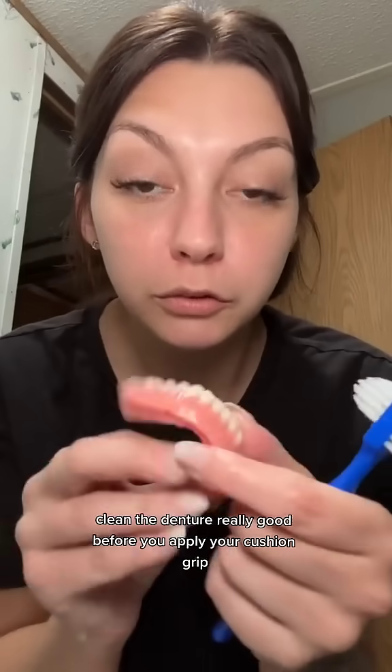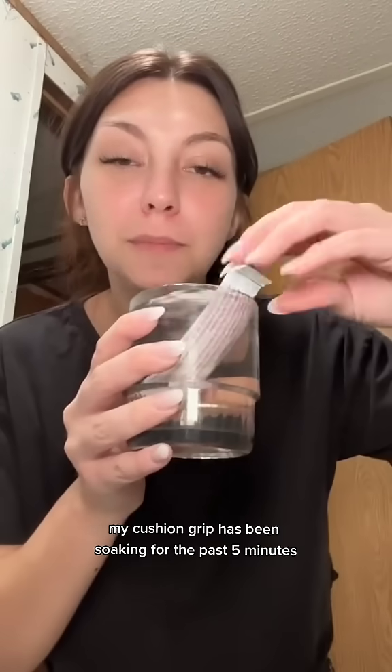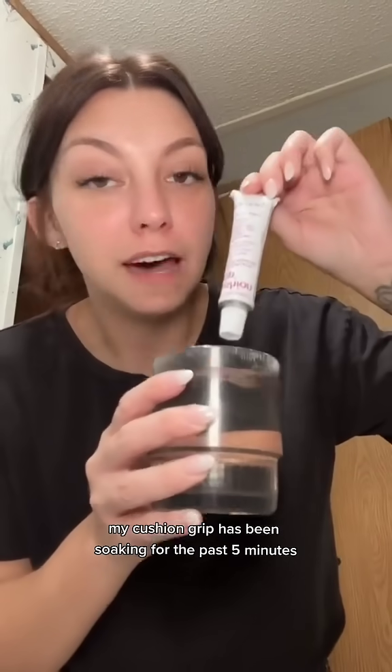Clean the denture really good before you apply your cushion grip. You want it to be completely dry. My cushion grip has been soaking for the past five minutes.